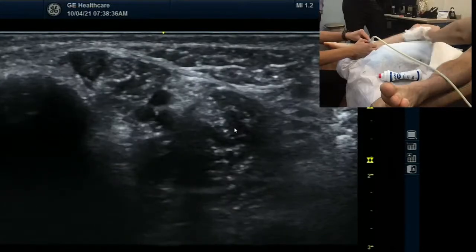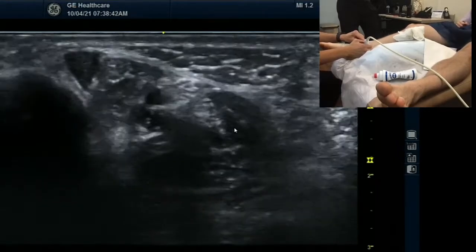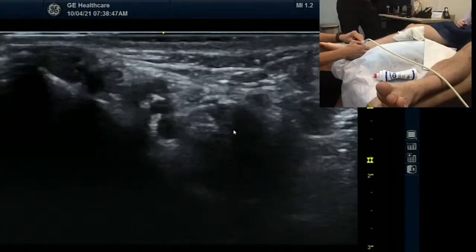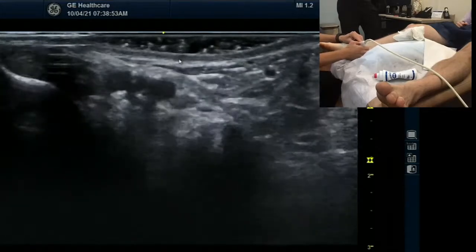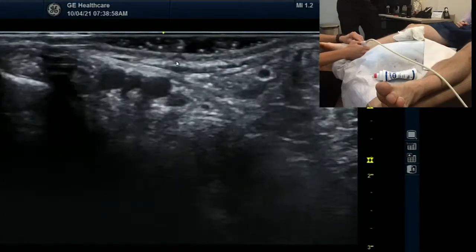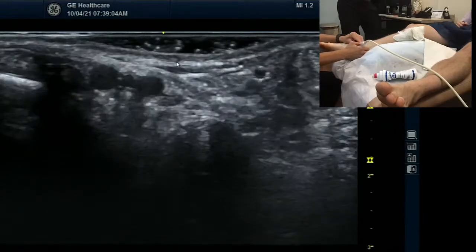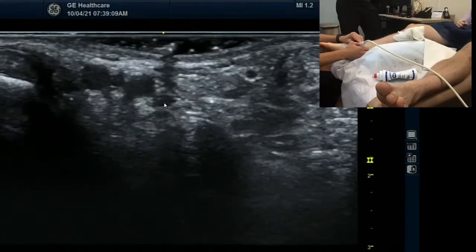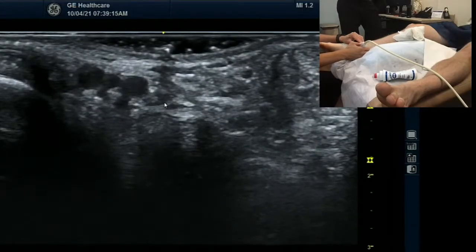Now, look at his ankle. Can you see it? I think so. Then let's go downstairs. Slowly. Where are you? Is that the — I see a division coming off — is that the flexor hallucis coming here? Yeah, the flexor hallucis right there. I wonder if that's the division coming off his tibial nerve going posterior. Last time when we were here, it was splitting. Yeah, it splits. So right here — I want — that's the tibial nerve. And I think that's the first division coming off. That's the division here.